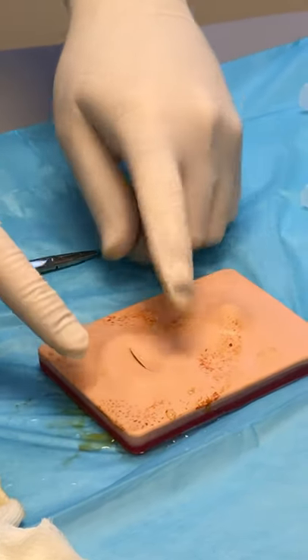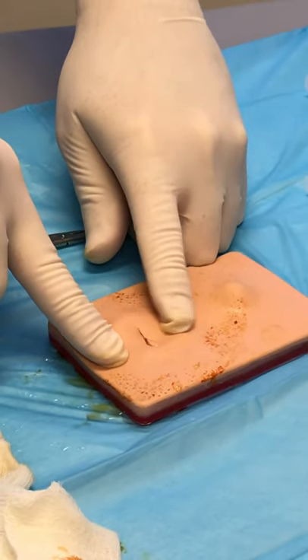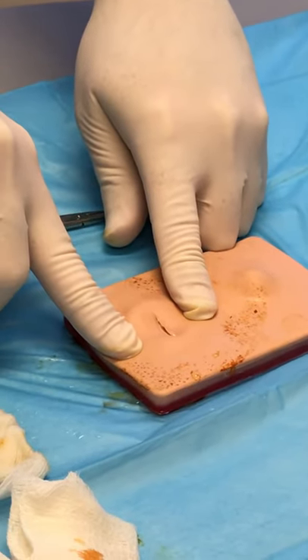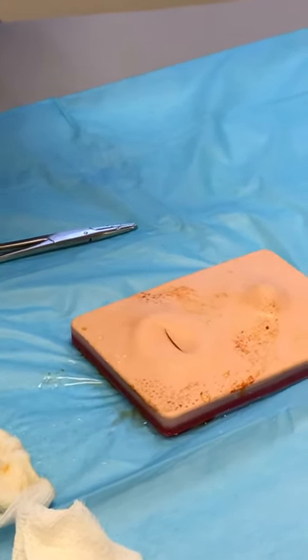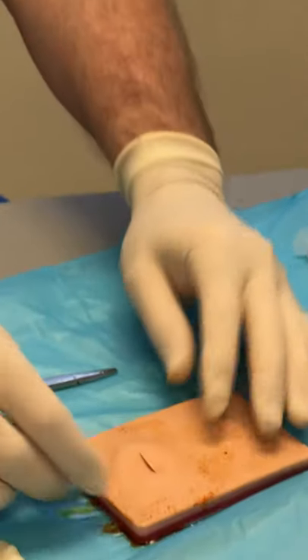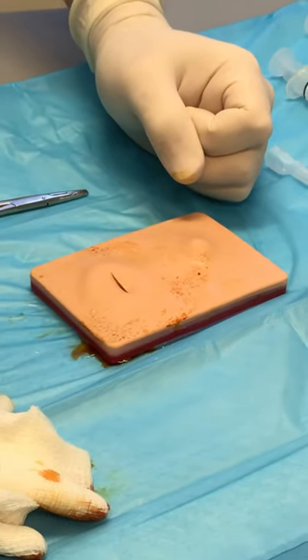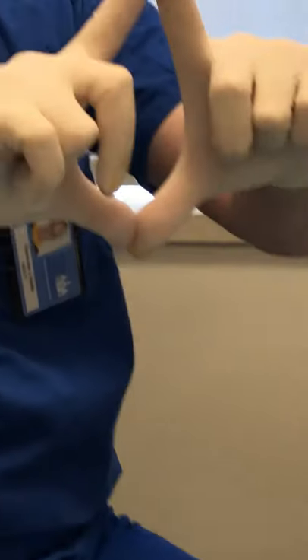Now the trick is: if I don't do anything more, there's a pretty good chance this will heal back together overnight and the abscess will just come right back. So usually if it's of any size, you want a strategy for keeping it open so it can heal from the bottom to the top by secondary intention. The worst case is if the top seals back together with germs still in there — they'll just form another abscess. If it's in a non-cosmetic area like the buttock, instead of a straight incision you can make a football-shaped incision so it's a little further apart and harder to close.